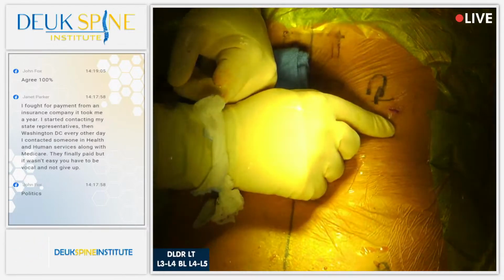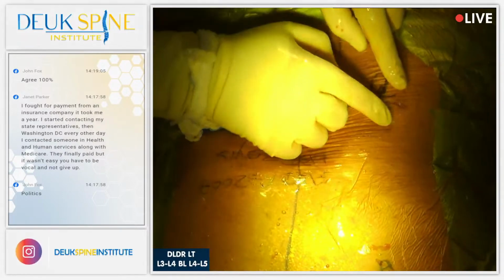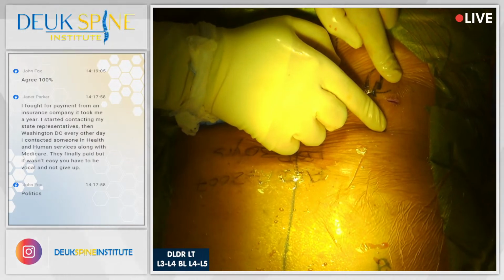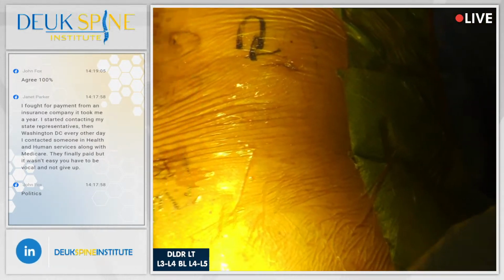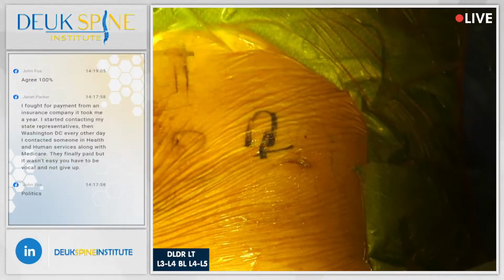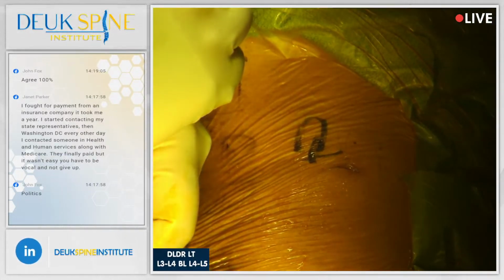All right, take a look here at the incision. Arius, you see this? Yes, we do. That's a 1/4 inch incision. We did one on each side because he had bilateral pain. And we're going to move on to the plasma rhizotomy next.